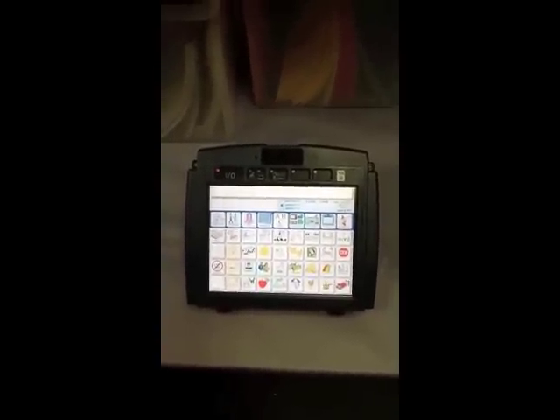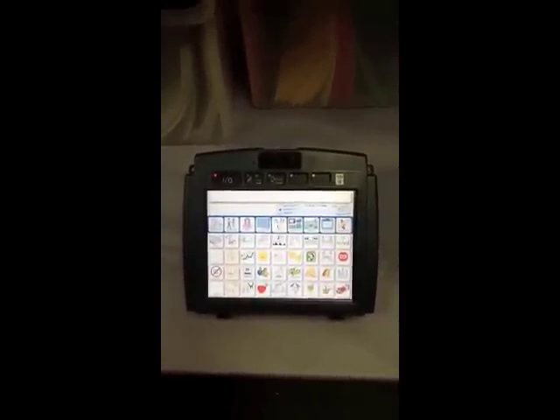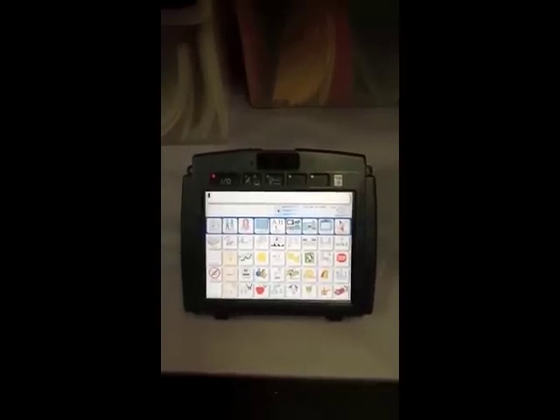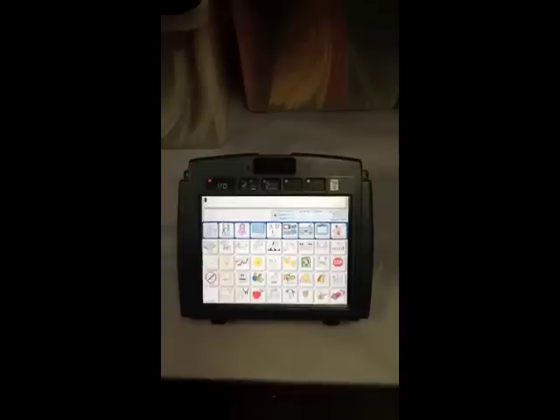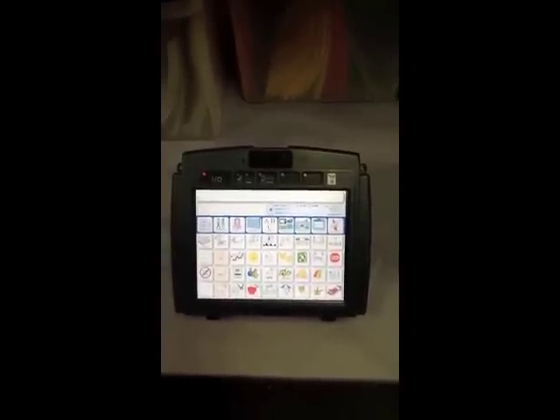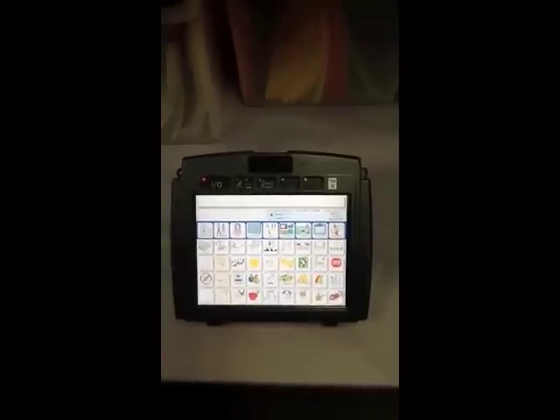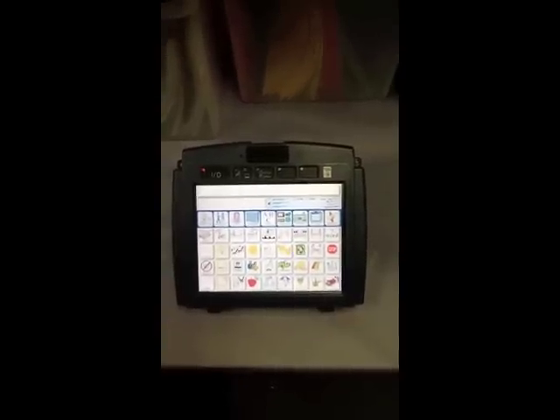When you call tech support, you can expect to hear an automated message. This message will ask you to press 1 if you would like to speak to a representative. This will send you to another automated message where you are asked to enter a number depending on the device you are calling about. At this point, we were placed on hold for over 20 minutes. The system did tell us that there were 4 callers ahead of us. Because this number never changed during the 20 minutes, we decided to hang up and try again at a later time.